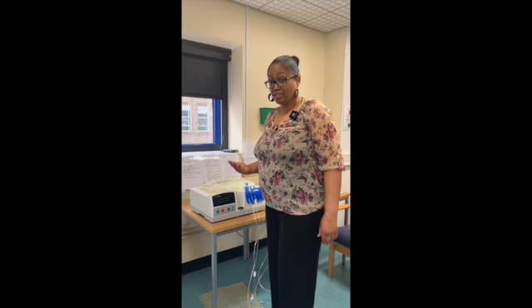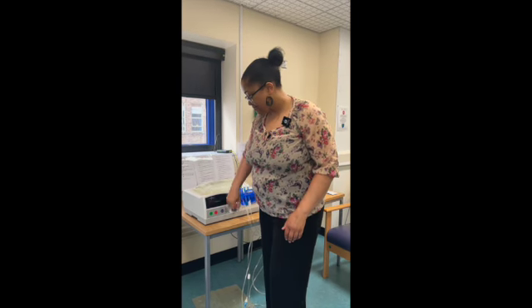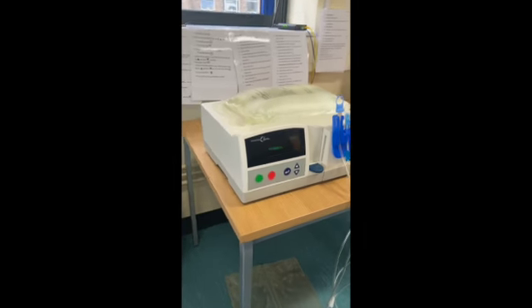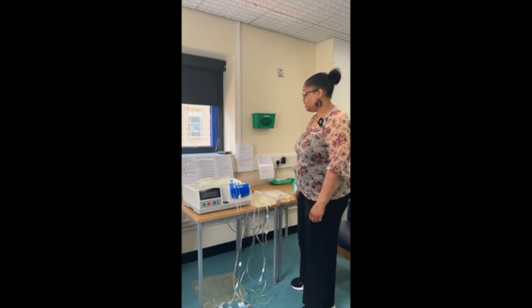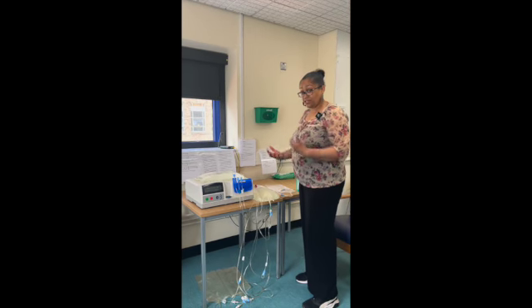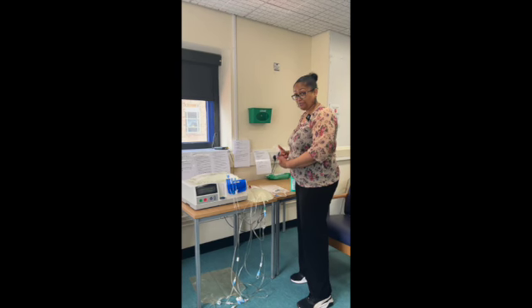I'm now going to press the button for the machine to start the priming process, which takes about 6 minutes. So while this happens, I can just get myself ready for bed. The machine is now finished priming, and I'm going to connect the machine to what's called a dummy bag. So this, for the purpose of this training session, is going to act as my peritoneum.